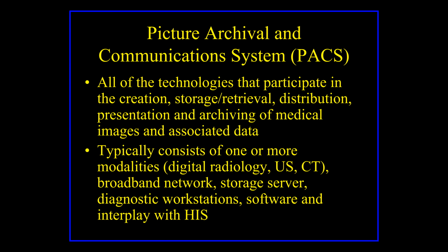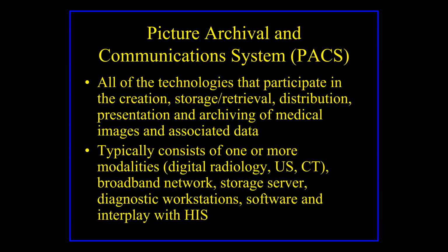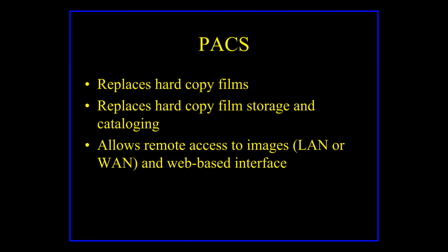If you have ultrasound in your clinic, you're going to store all the ultrasound images on the same PACS. And if you have CT in your clinic, or a CT that's done elsewhere and they send a copy to your clinic, you can store Fluffy's CT as well. So if you type into your PACS that you want to see all the images from day one on Fluffy Jones, it's going to pull up every image from every date, whether it is an ultrasound or a CT, and show it to you for that animal. That's what a PACS system does.